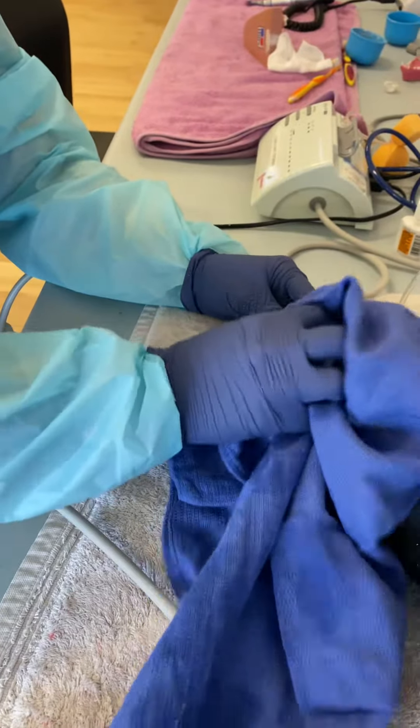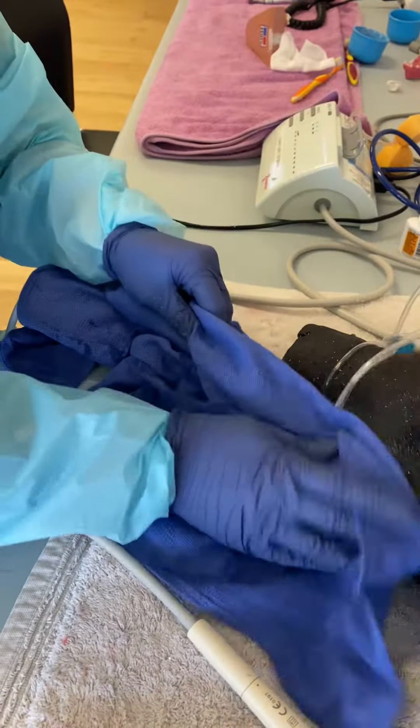And now I'm just going to clean and dry my patient so they're not getting too cold and wet.